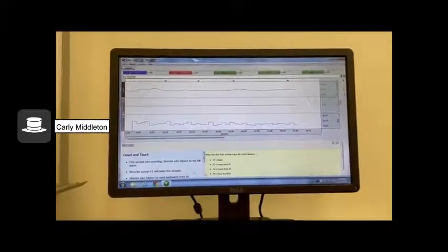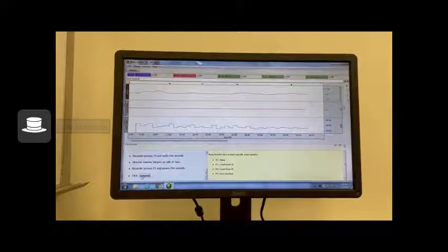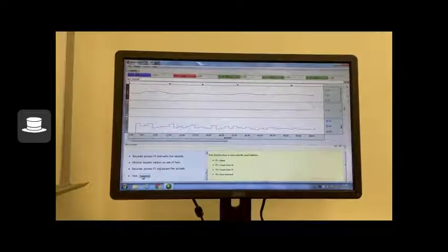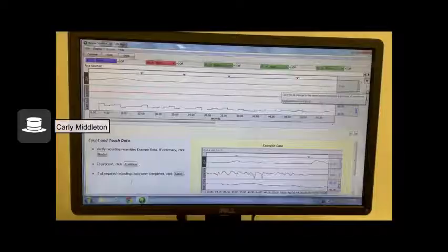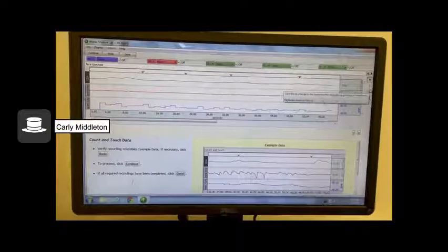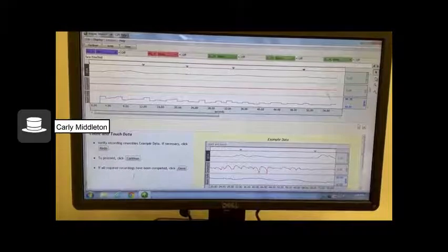After you've asked all of the questions, scroll down and click Suspend. Now that you have the data, we can start to analyze it.